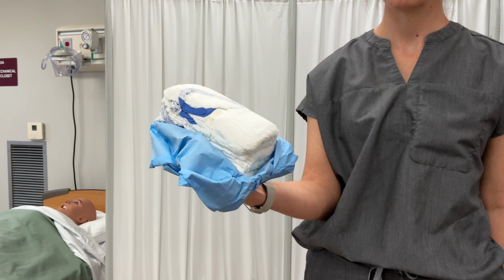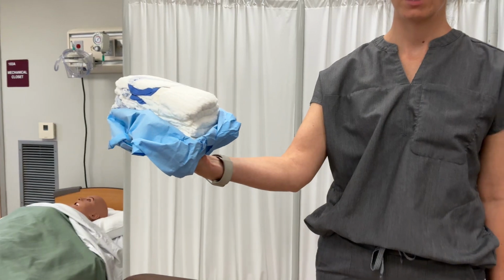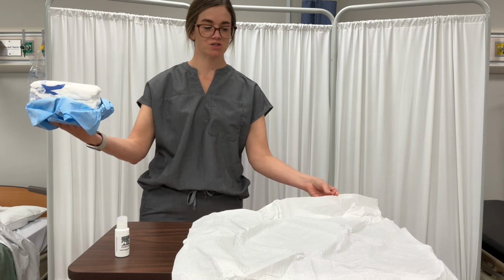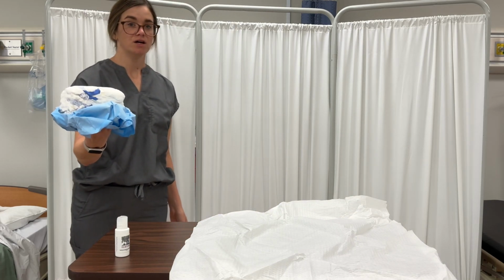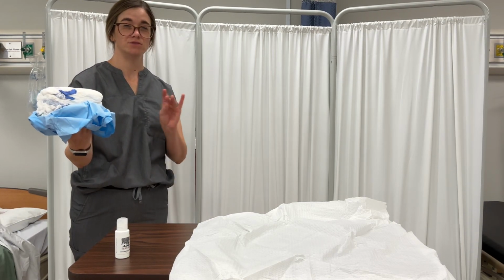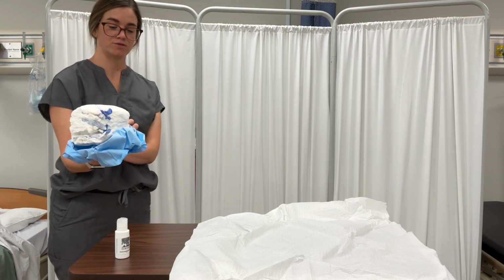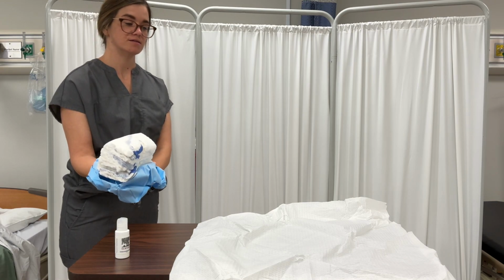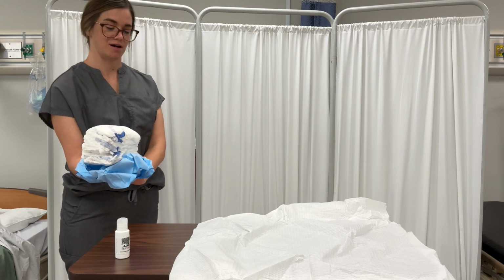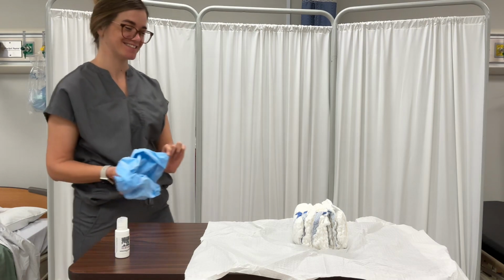in order to expose the lap sponges. And she's going to hand the items to the instructor or toss the item onto a sterile field. Okay. Would you like to get me a sterile field, ma'am? Yes. So we're going to pretend like this was just opened and it is a field, okay? So you don't want to drop on top of it, because you could potentially sprinkle contaminants. You're going to toss it in, and hopefully I'm going to be able to make this. You have to get it inside of that 1-inch border, all right? 1, 2, 3, just like that. Okay, let us know if you have any questions.